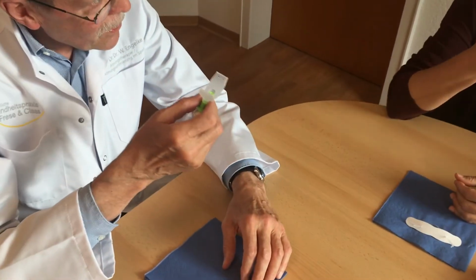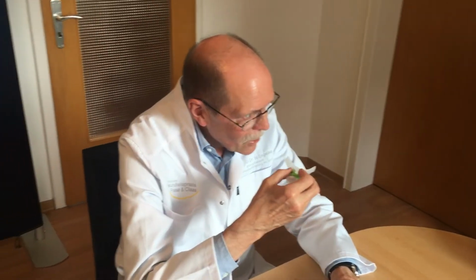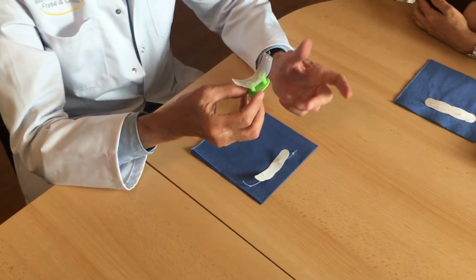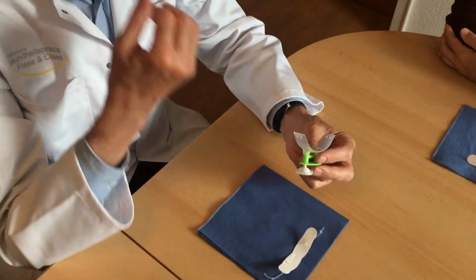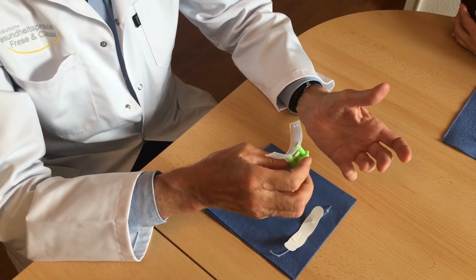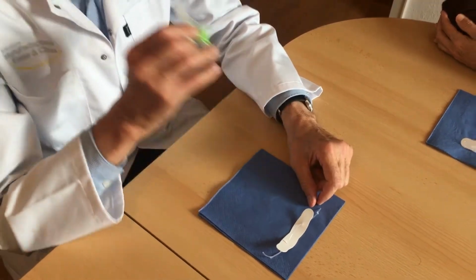Now I first will show to you how to do it, and afterwards I suggest that you make the same exercise. So the activator is placed between the teeth and the lips, and the only thing we have to do is swallow and observe what is happening.